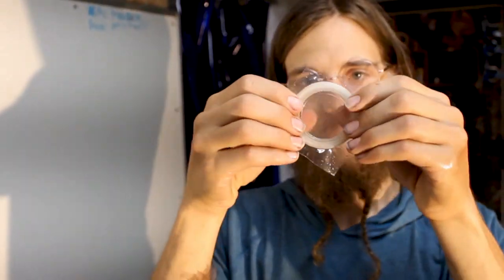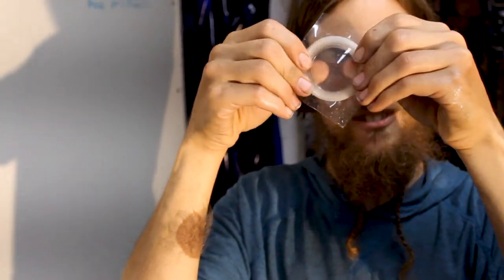Wow, cool. Yeah, let's see. Here we could probably do some funny zoomy stuff. Great. Isn't that cool? That is cool. Anyone with a 3D printer could have glasses if they needed them.